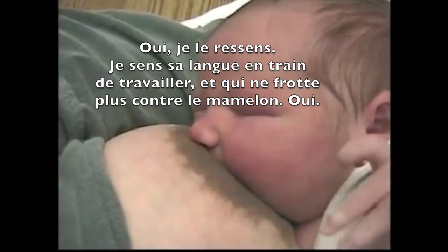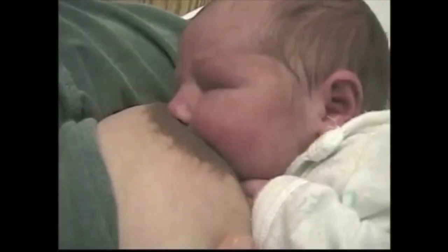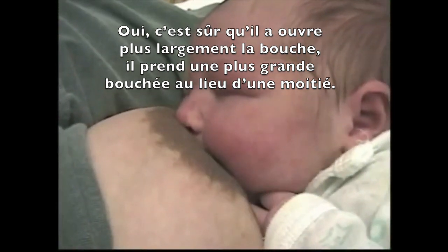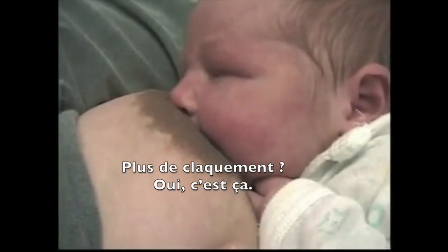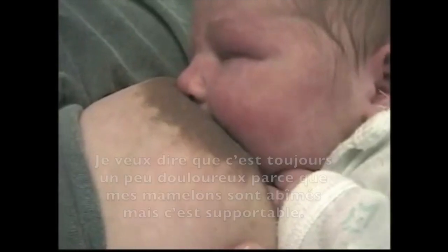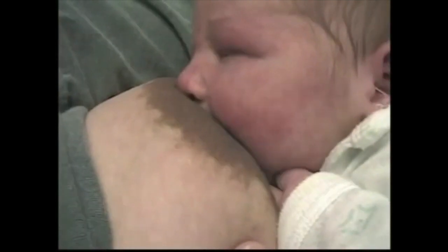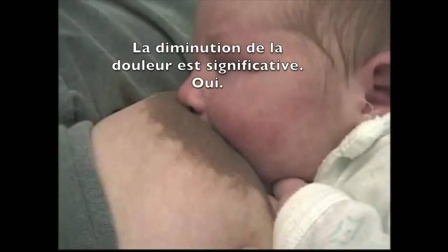I can feel his tongue moving against me more. How about the gumming that you were feeling before? No gumming — he's not biting. He's definitely getting a more full pull instead of just half of it. And a swallow, but no clicking. Your pain is still down to a one? It's uncomfortable because it's traumatized, but it's not worse. One or two — definitely not a six. That's a very significant drop in the amount of pain.